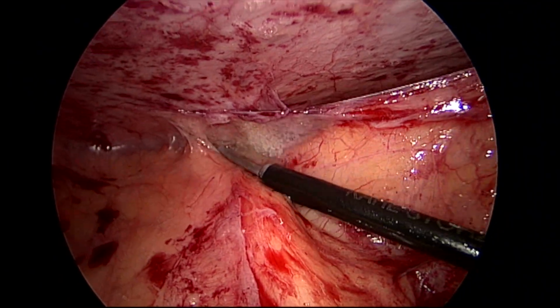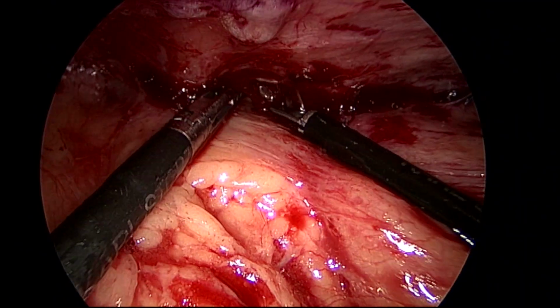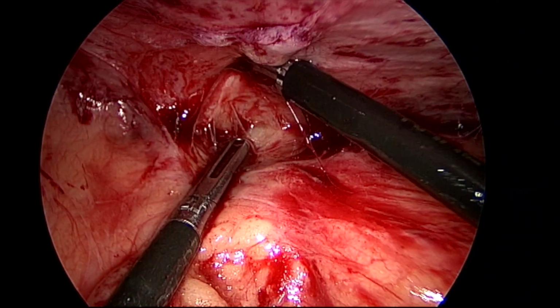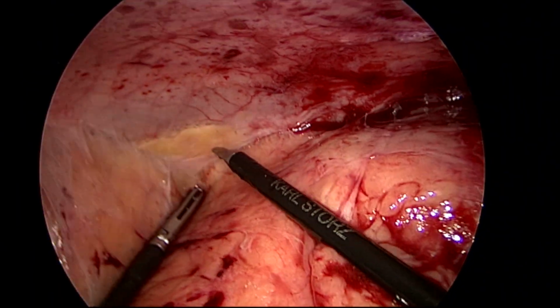Identification of anatomy is a little difficult, but if you carefully follow the structure, you can find it out. So I'm slowly able to enter laterally.